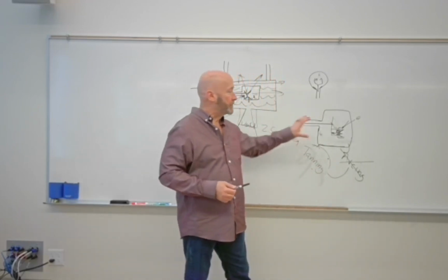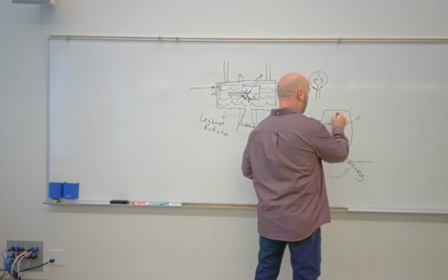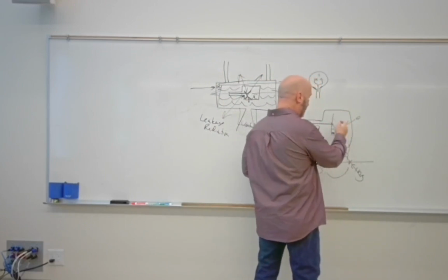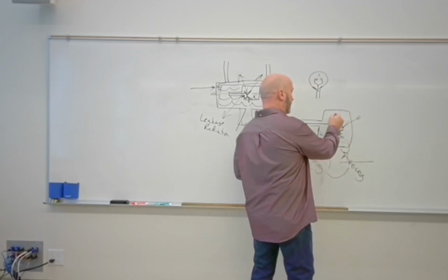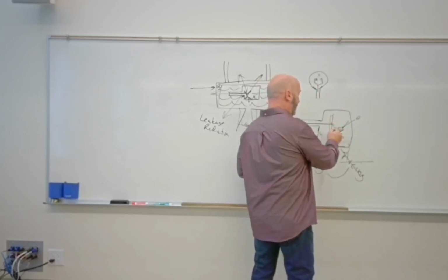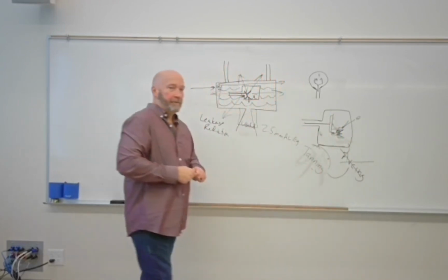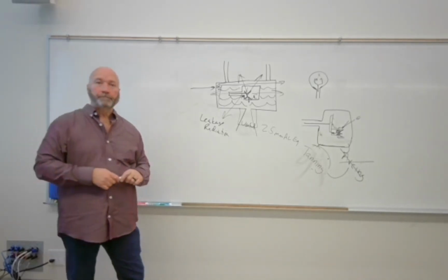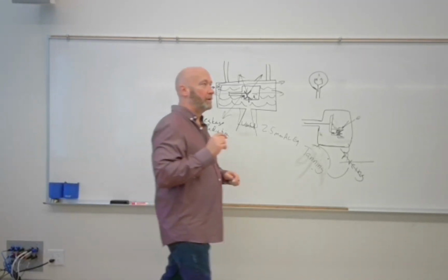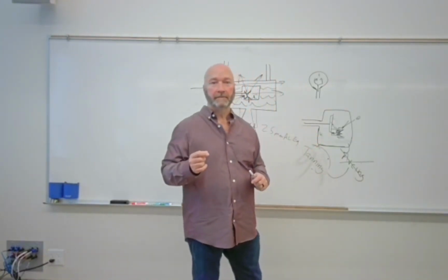So sometimes they'll use a graphite backing, so the entire disc, or at least the focal track, will be primarily tungsten, but maybe we've got a backing that's made out of something different. Graphite is very light, so it makes it easier to rotate. It also conducts heat less.